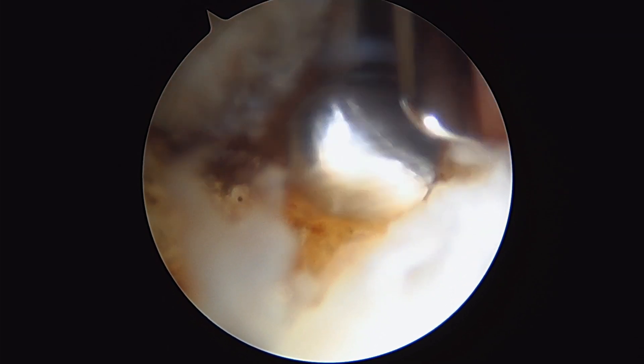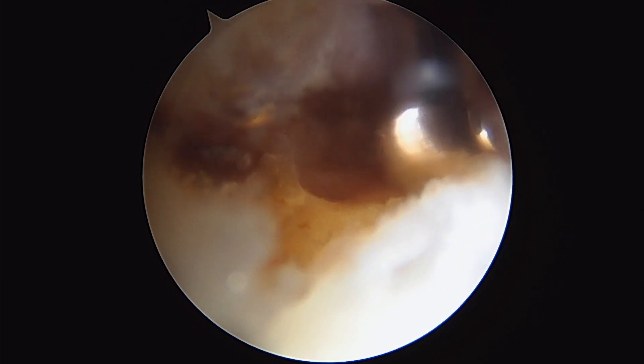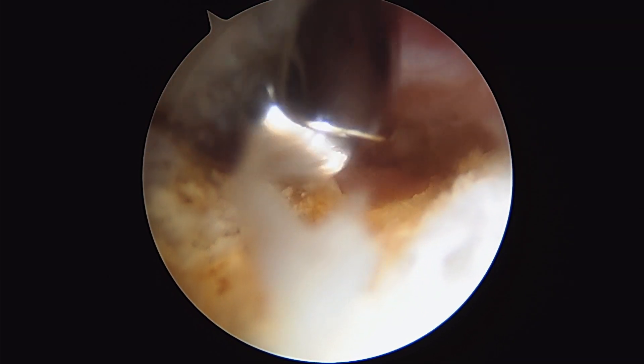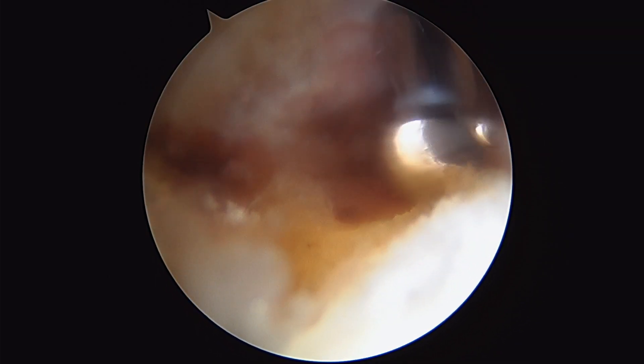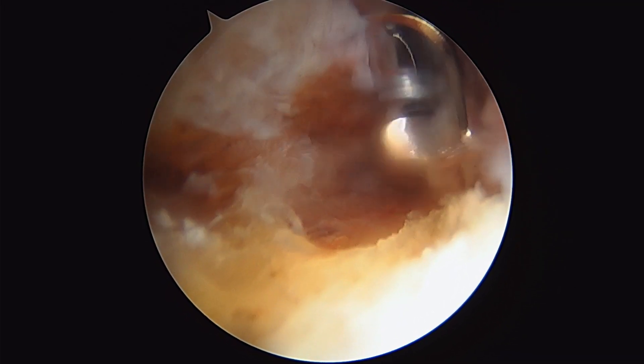Restoring normal hip architecture along the acetabulum is going to restore normal mechanics and movement, and allow us to fix the labrum into a normal anatomic position. You can just about see that that first bony lesion there is gone.